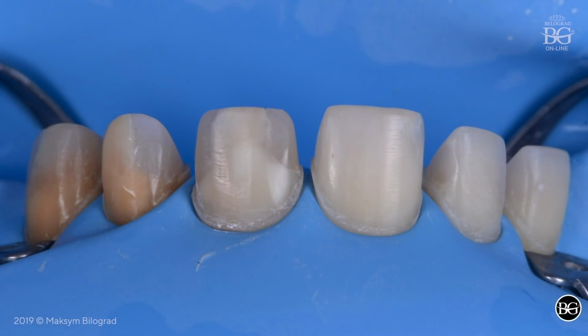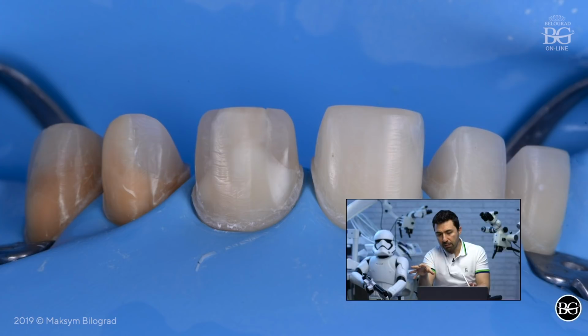That's why we placed rubber dam. Okay, we placed rubber dam to remove old fillings, to fill these cavities with a new fresh composite, and to prevent leakage, to prevent bleeding, and many other things. So we used this rubber dam for that procedure, and then we took advantage to prep with rubber dam. So basically, we finished step 1 of preparation before placing the rubber dam. Then we placed rubber dam, removed the filling, put the new ones, and then we finished our preparations with rubber dam on.